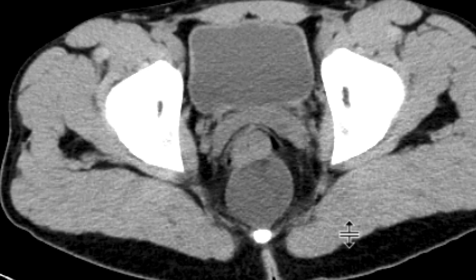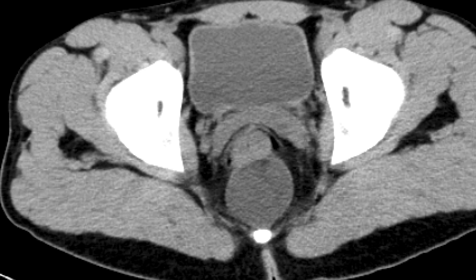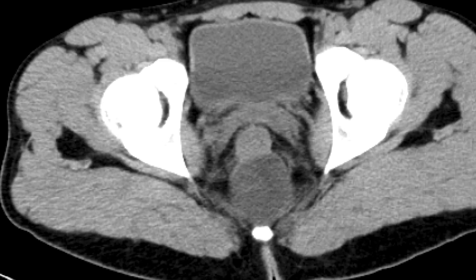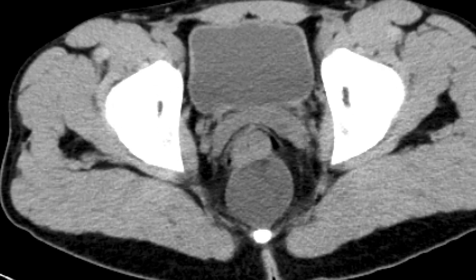If you look at it, most of it appears to be pretty low density — if you measure it, it almost looks like fluid density. And a small portion of it, very subtle, you can see has a little bit of fat density within it as well, just a sliver of it along its anterior aspect.